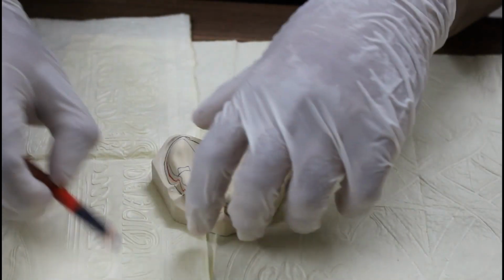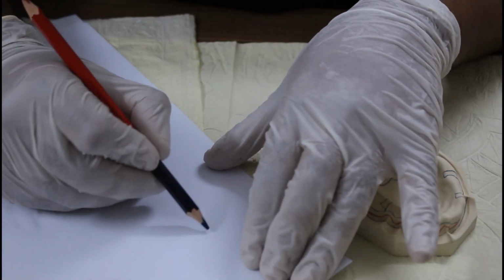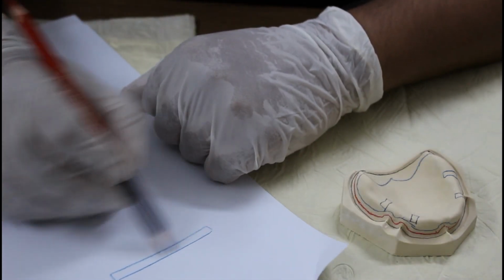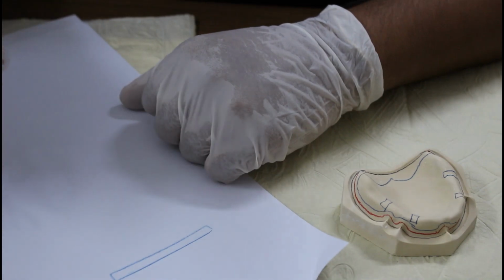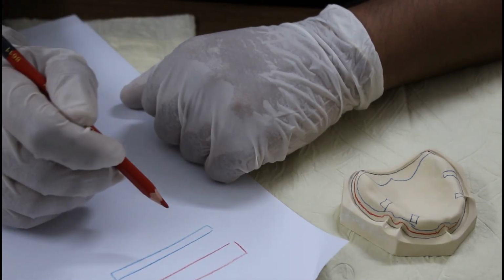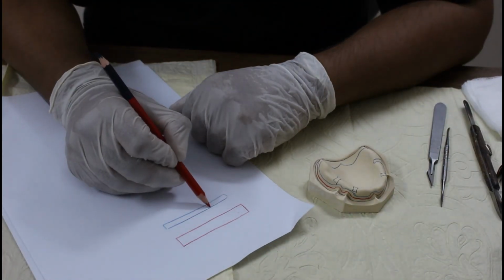Now what is a tissue stop? I will tell you. Now this is the bone, or this is the ridge. This is our tray. Okay. Now this is the tray, this is the ridge.